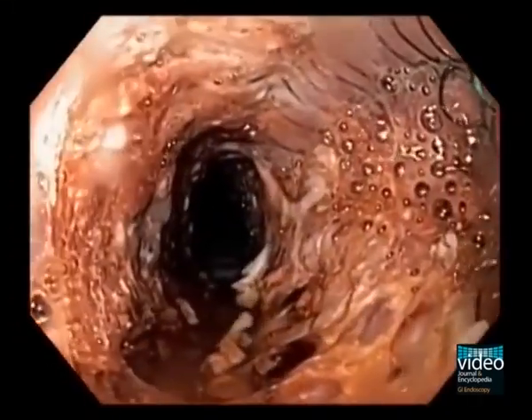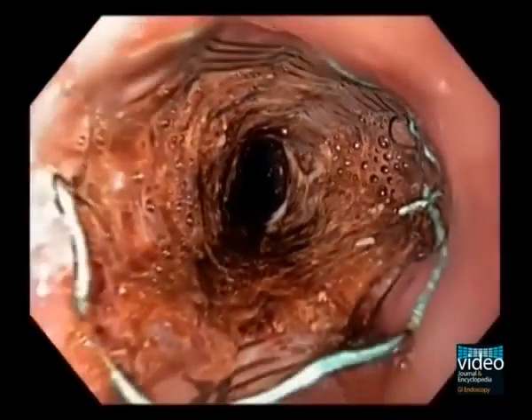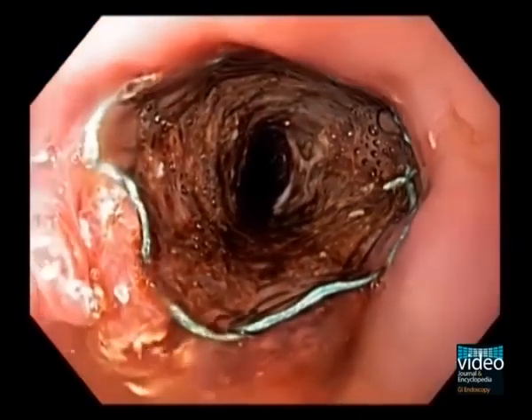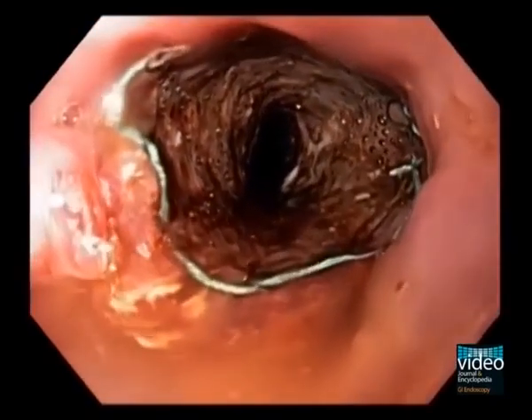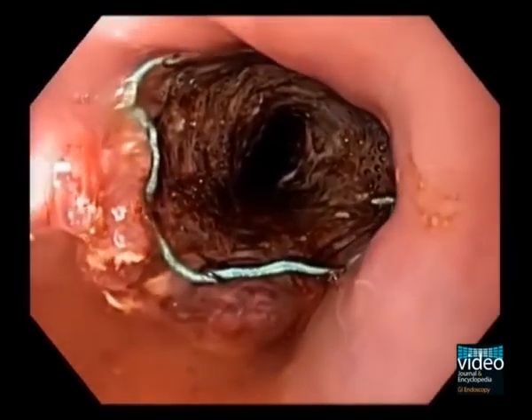You can see the stent is in excellent position. Tumour is visible through the stent entrance and the stent is widely patent.